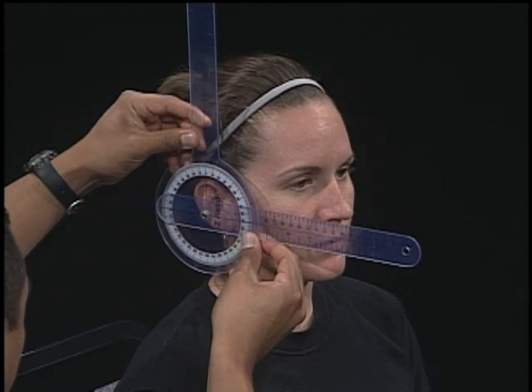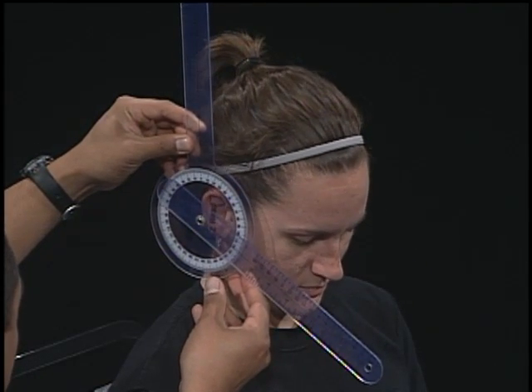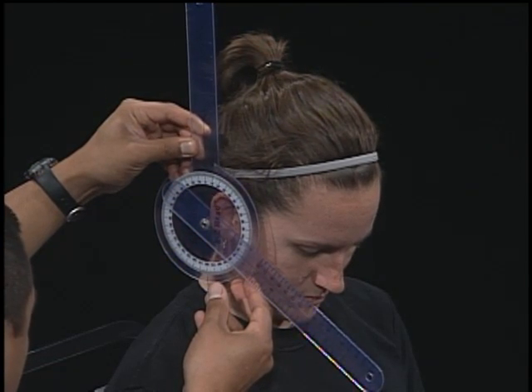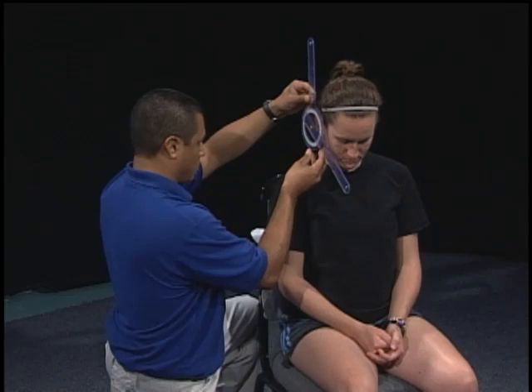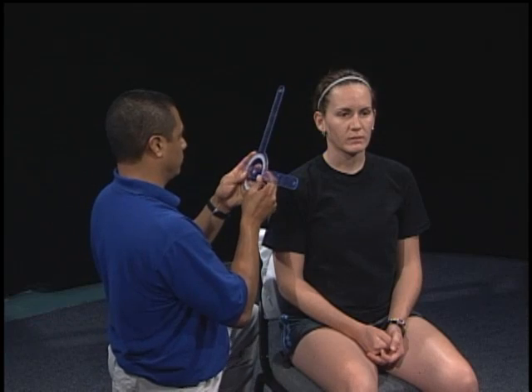Ask the patient to perform cervical flexion as previously, maintaining the goniometer in alignment through the entire range of motion, and observe for any extraneous movements of the trunk. Read the degrees of motion on the goniometer and then ask the patient to return the head to the starting position. Remain at eye level of the goniometer when reading the measurement.